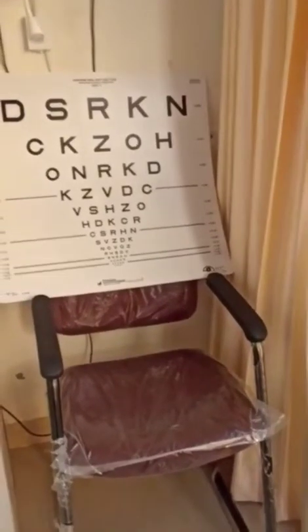Any other daily activities where you feel difficulty? Any specific things, except the reading problem? No, correct. So we'll check one by one, step by step, and then go for the assessment. Can you read that?